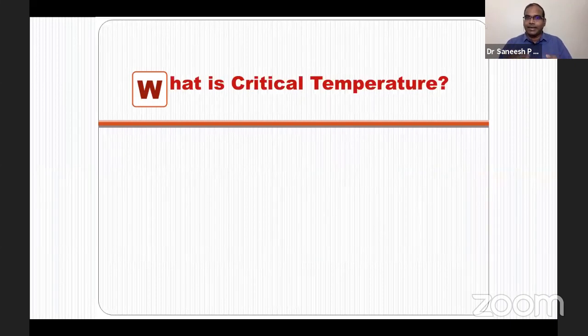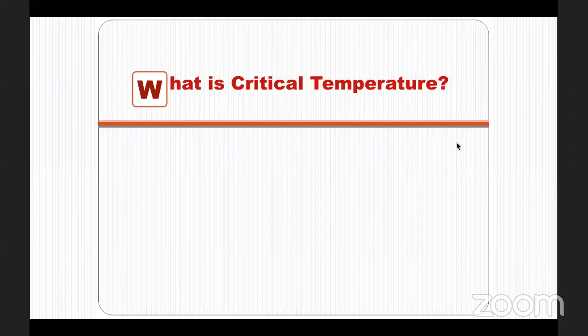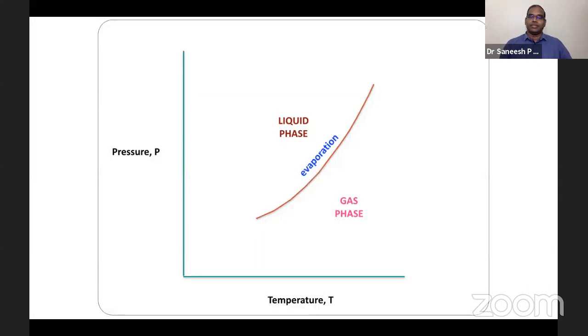And can you explain what is critical temperature? Because I think you almost mentioned it also. Critical temperature is the temperature above which a gaseous material cannot be condensed into a liquid. Excellent. For those who are new to this concept, some substances exist in gaseous phase and liquid phase. The changeover is called evaporation. Liquid evaporates into gaseous phase. But as temperature increases beyond a particular point, however much pressure you apply, you cannot compress it into liquid. That is called the critical point. Critical point is the point above which, however much you raise the pressure, you cannot bring the gaseous phase down into liquid phase.